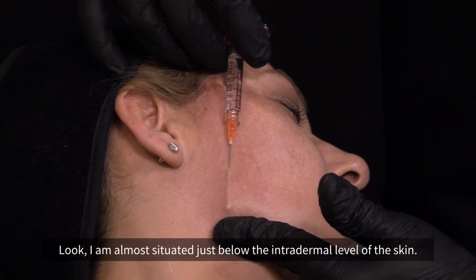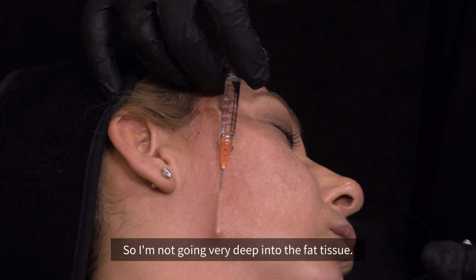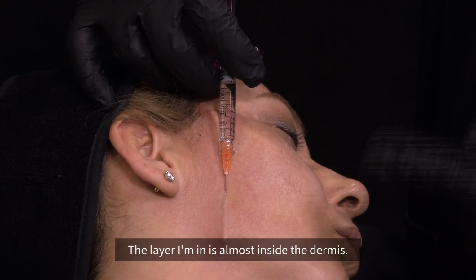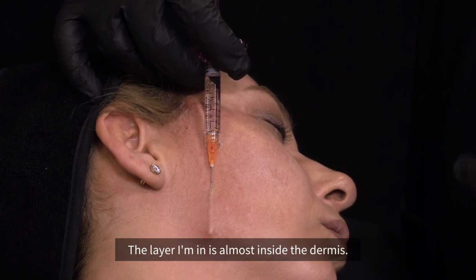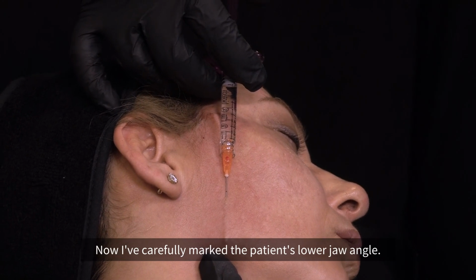Look, I am almost situated just below the intradermal level of the skin. So I'm not going very deep into the fat tissue. Look, my needle cannula can't move left or right. The layer I'm in is almost inside the dermis. I'm extremely superficial. Now, I've carefully marked the patient's lower jaw angle.